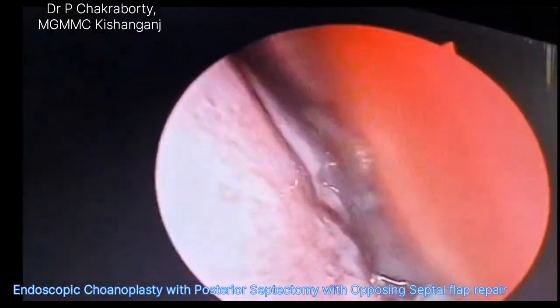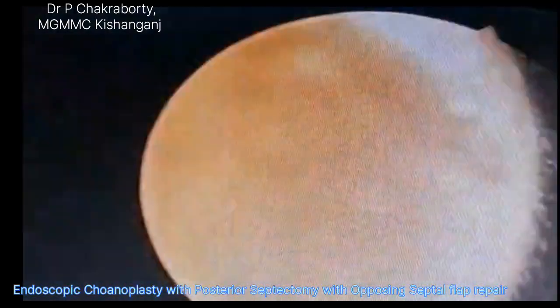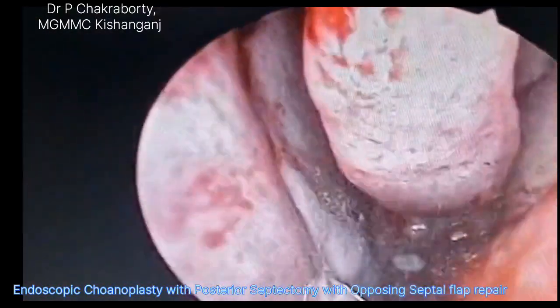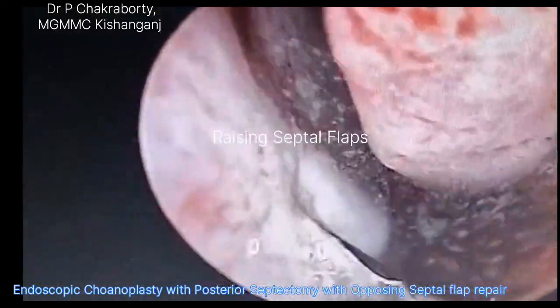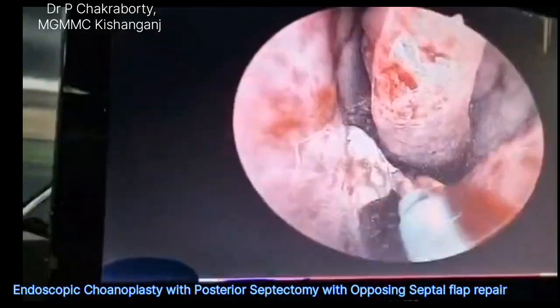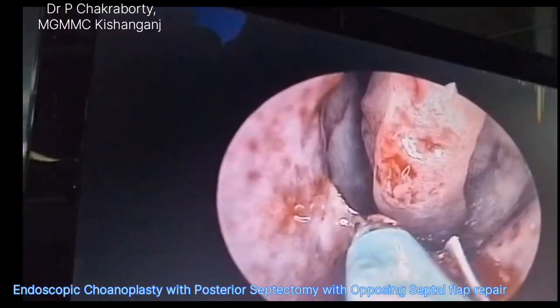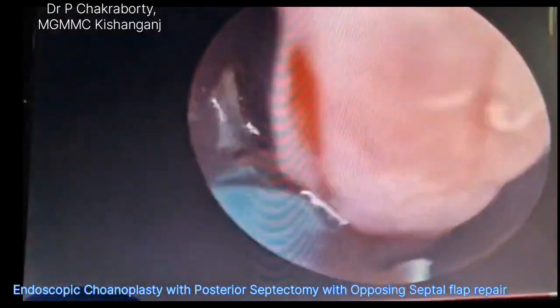So here we are trying to create some space by lateralizing the inferior turbinate, and now we are putting incision in the mucoperiosteum of the posterior end of the septum using a modified circular knife, insulated circular knife with electrocautery.